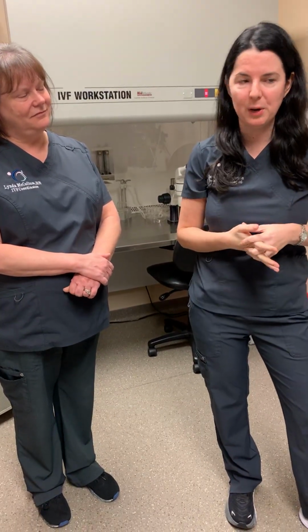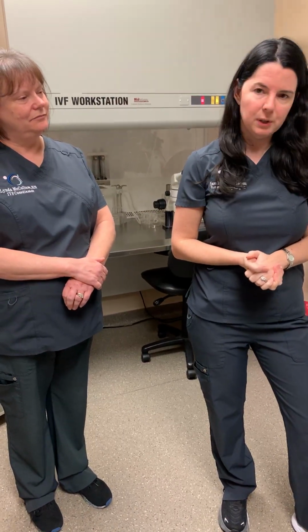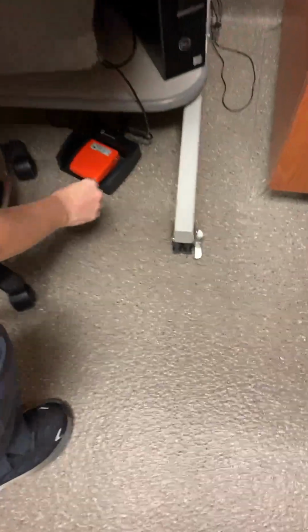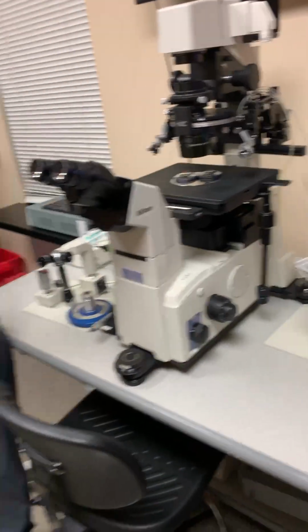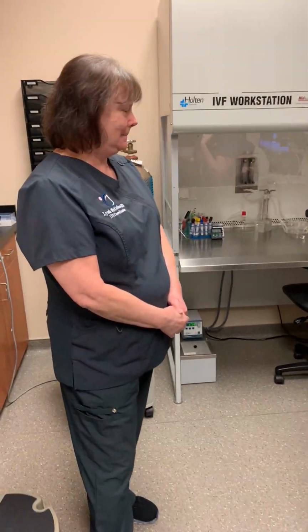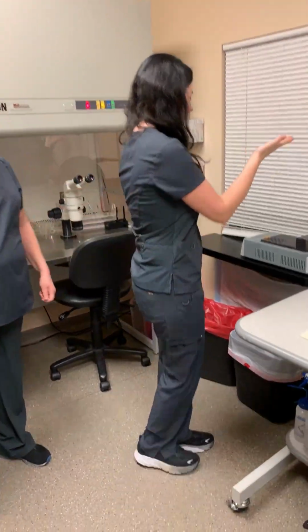And that's an all-inclusive price, so it's not something we're charging patients extra for. If we determine that the embryo would benefit from it and the patient's pregnancy would benefit from it, we can do it. We're not charging anyone anything extra for it. But it's really cool technology, and it's got a foot pedal. This little foot pedal down here, pull it out. That's what we use to shoot the laser. Yeah, it just shoots. Wow. Laser. No, I'm just kidding.